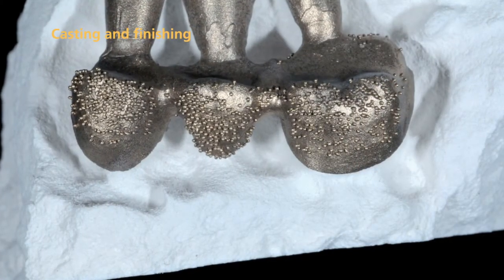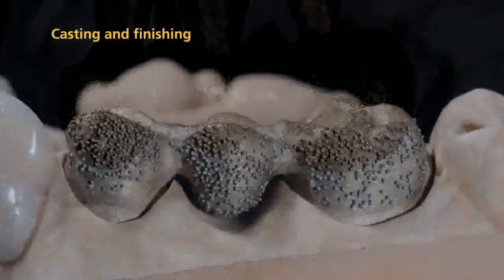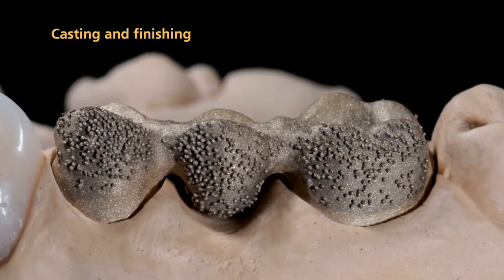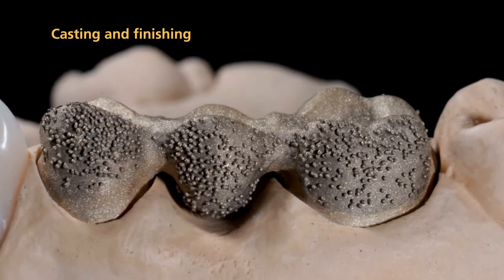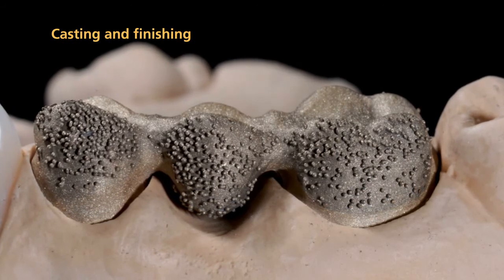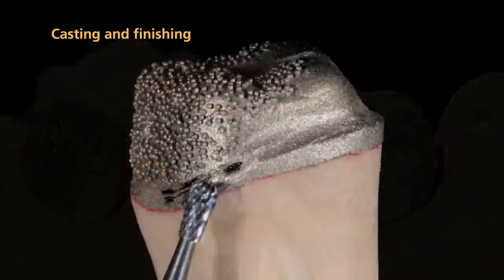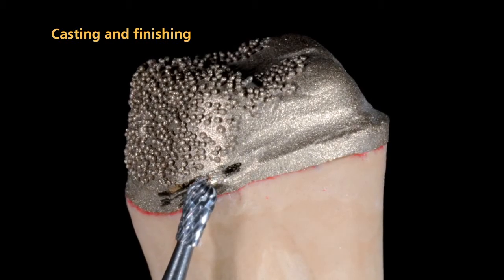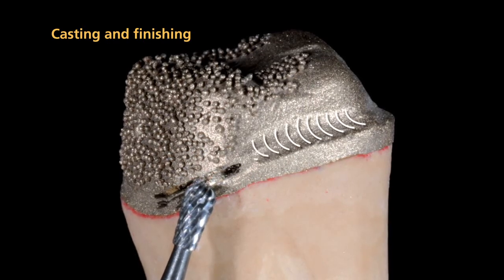After casting, carefully divest and sandblast or pickle the framework. Subsequently, fit the framework on the model. Mechanical retentions are generally beneficial and recommended because they support the chemical bond between the metal and composite. After you have separated the framework from the casting sprues, you can finish it. Create a chamfer in the cervical area using a tungsten carbide burr.